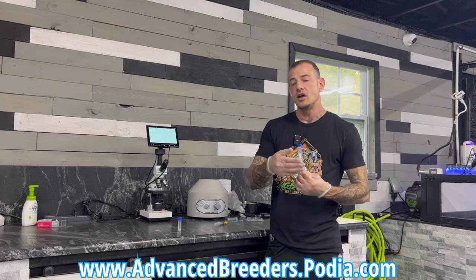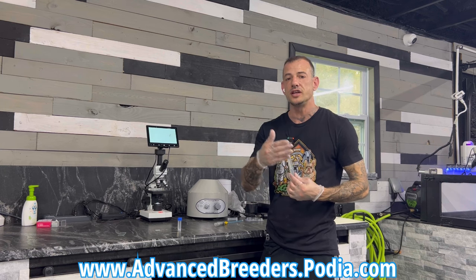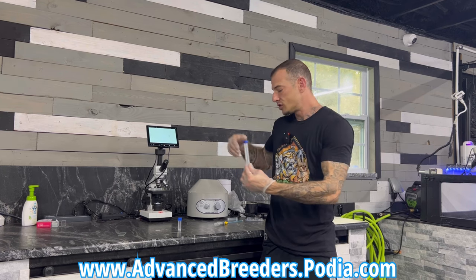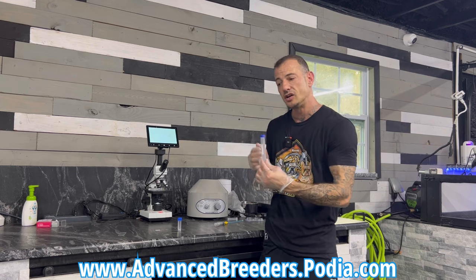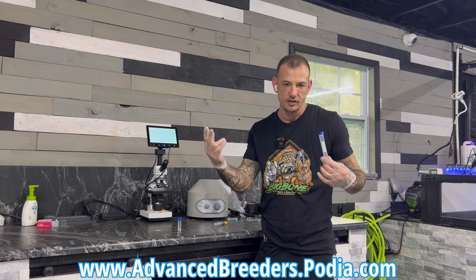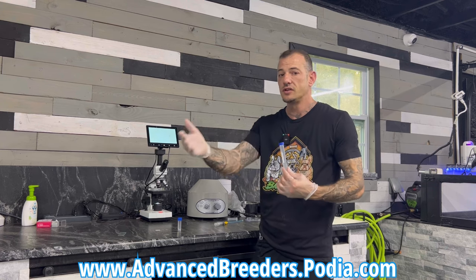Also, when doing inseminations, on my website I sell the best semen extender in the world — it's really starting to catch traction now in the States. It's from Europe, it's called Hoke, and there's also a semen enhancer that they sell. You would take your collection, spin it down to your pellet, pull the prostatic fluid out, then add some of this semen enhancer, then do your AI with that. It's like a caffeine boost — it's going to give the semen more food to live longer and give it more energy to be active and try to fertilize the egg.